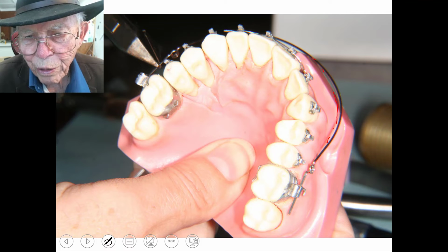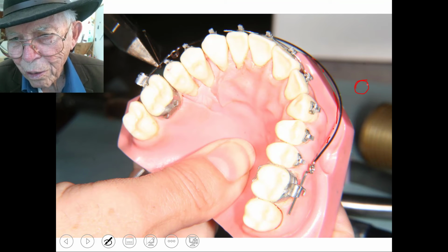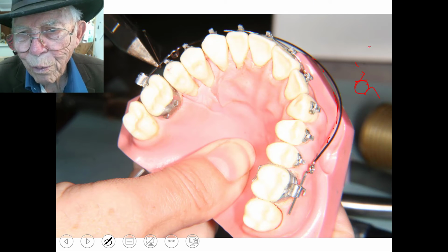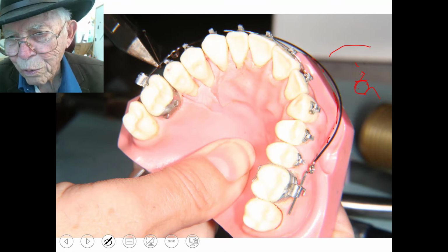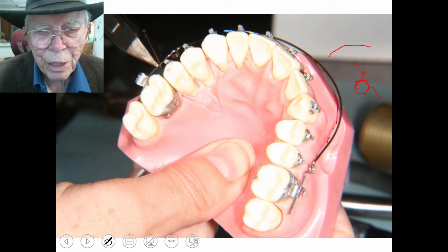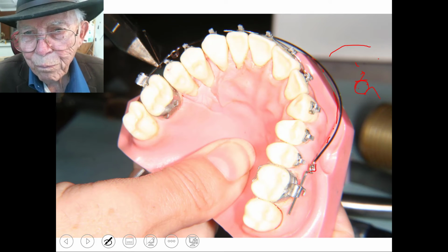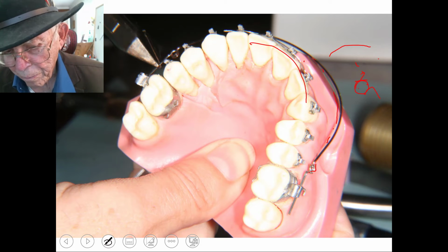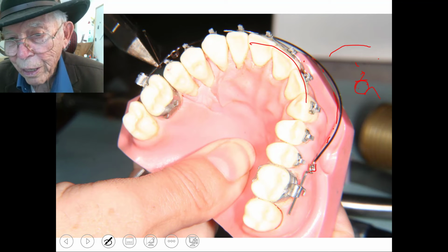Now, as we pull this down, it tightens that loop. It is out like this, and we're pulling it down, and we'll tighten that up, where this would be headed up instead of down. You see, right like it is here. Now that's going to pick these teeth up right in this area of the mouth, and it will actually straighten anybody's teeth.